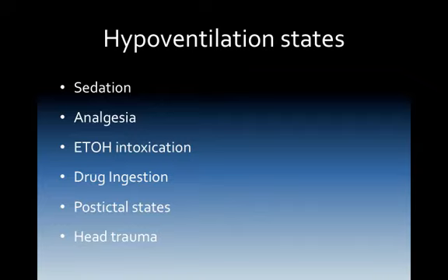ETOH, or alcohol intoxication, low ventilatory states would increase the amount of end-tidal CO2. In these, if they are hypoventilative, we will increase the amount of CO2. Drug ingestion with respiratory depression also increases the amounts of end-tidal CO2. Postictal states. Is the ventilation improving the postictal state or not? Increasing amounts of end-tidal CO2.